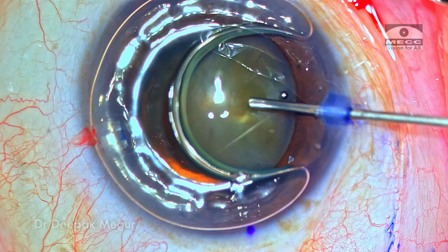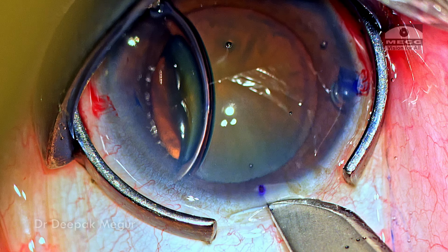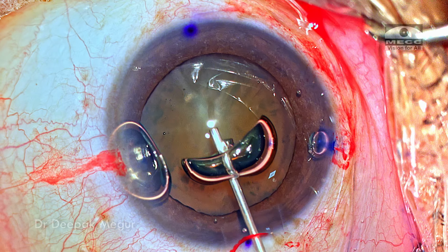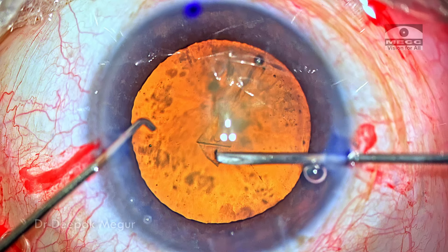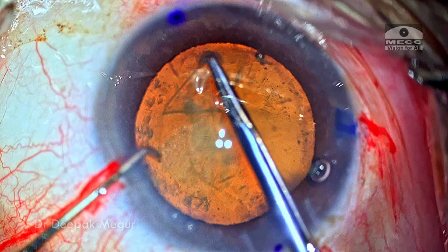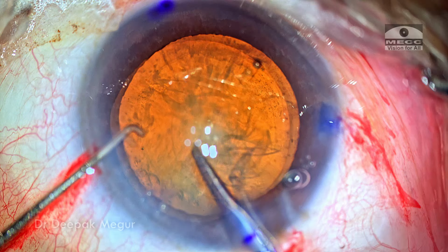It looks like we are working way deep in the eye. So I just want to pull out the fragments. So that's the reason I'm going to plan a slightly bigger rhexis. And let's see how things turn out. OVD is placed to deepen the chamber and care is taken not to overpressurize the eye. I'm using the forceps to perform the rhexis.